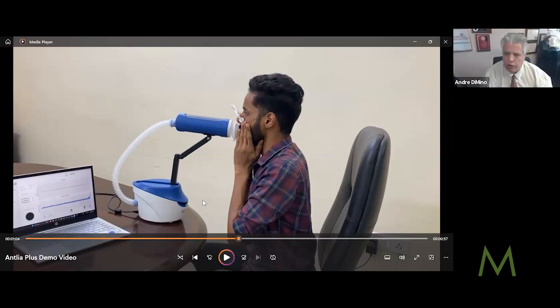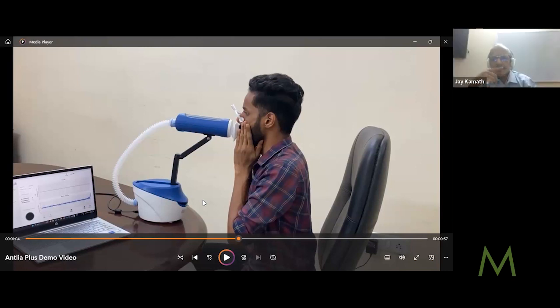Yes, thanks, Joe. Just a question, because we worked on a device for peak measurement using a pneumotach for measurement on a spirometer. Since you're not asking the patient to exhale to a maximum and so forth, and you're just taking normal respirations, doesn't that become variable because the patient can vary it between your tests? They could increase their inflow or outflow because they're just sitting there breathing. This is different from a spirometer, if I've understood your question. Here I generate sound waves, frequency 5 hertz to 40 hertz, and this gets superimposed onto the patient's breathing.